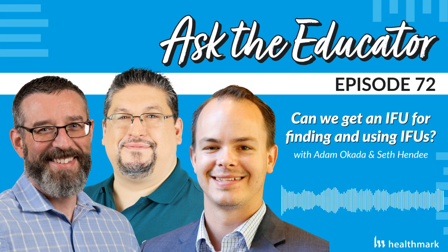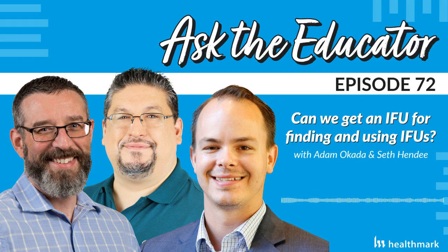Thanks, Kevin. Biggest thing is the amount of pride that's initially shown when we ask about IFUs and how you keep your IFUs, and someone says they're all electronic, they're all digital, right? Now the big name in the room that we all know is one source, but there's others, and again, beaming with pride that they have one source. And I say that's great. So if I were to ask this technician at the workstation here to help us out, they would be able to access an IFU. And that's where the stumbling and sometimes the outright falling begins.